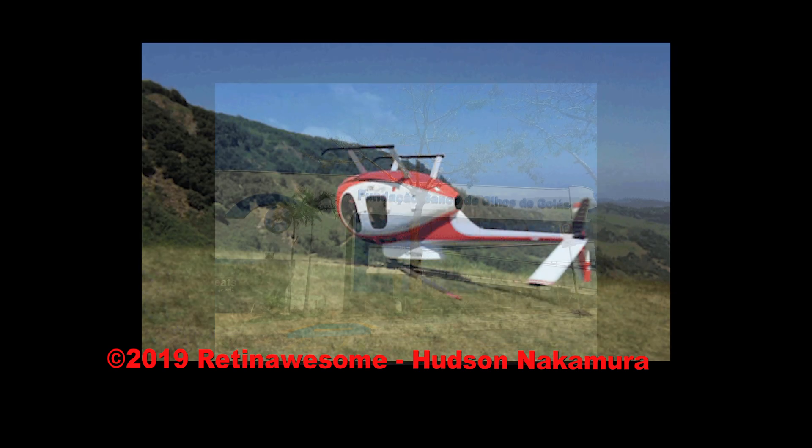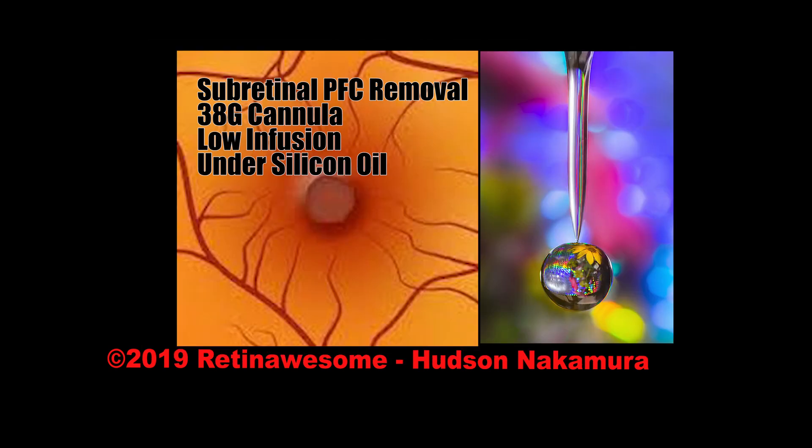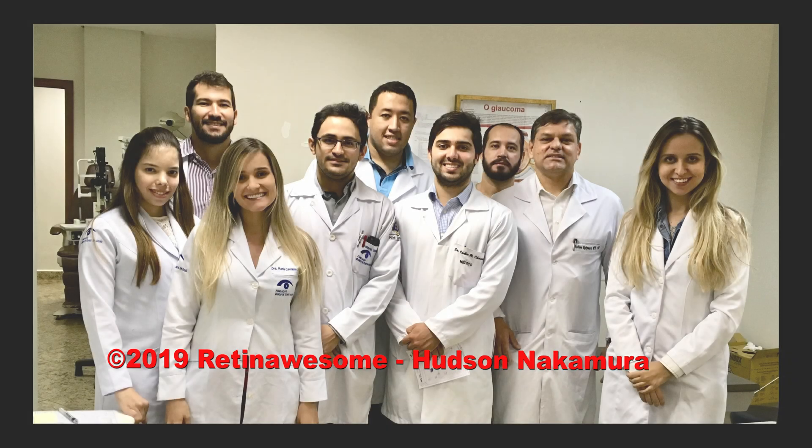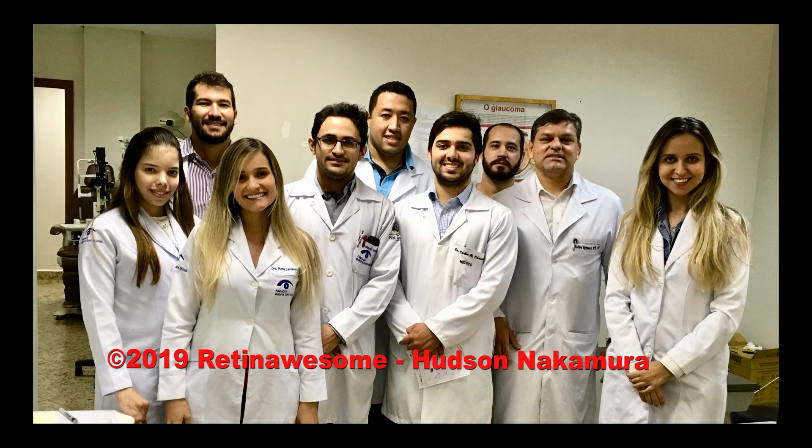This is inverted vitrectomy, subretinal PFC removal with 38 gauge cannula, low infusion and under silicone oil.